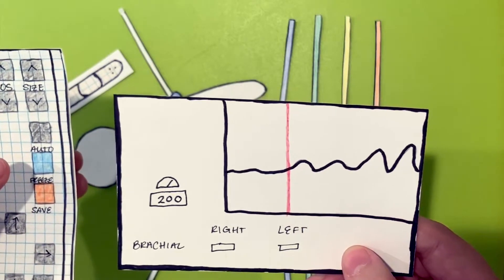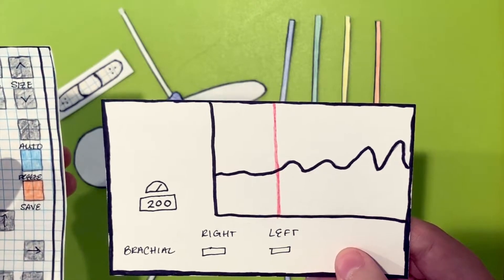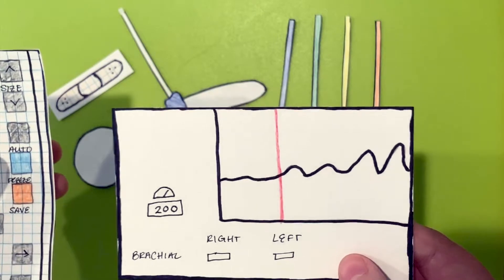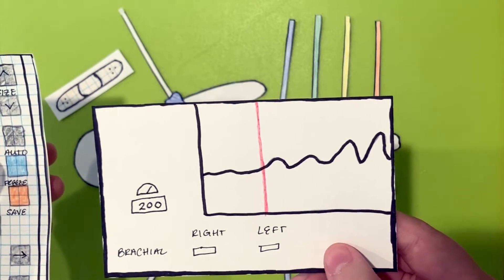Then you will repeat on the other arm. You will use the higher of the two pressures for calculations. If there is a greater than 20 pressure difference between the arms, this could indicate subclavian artery stenosis.